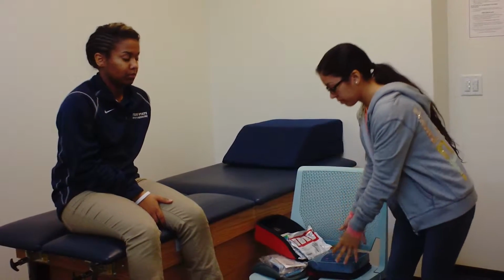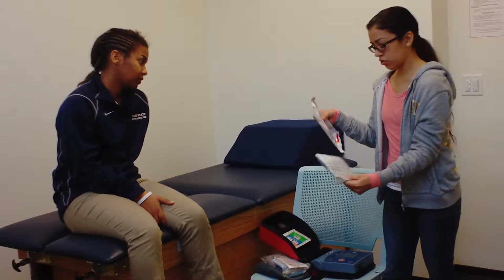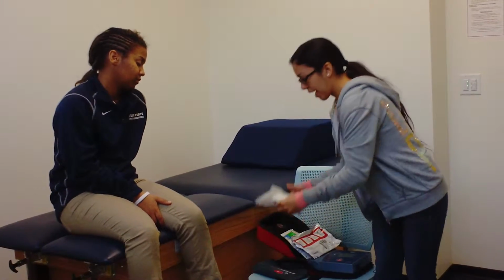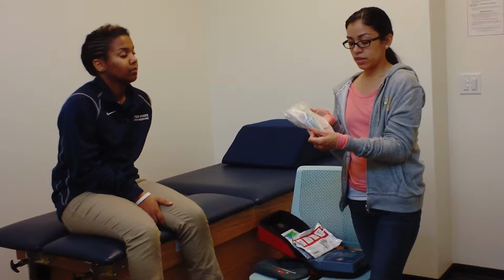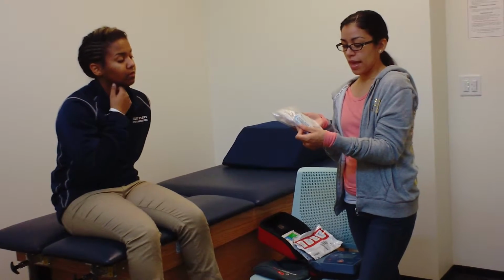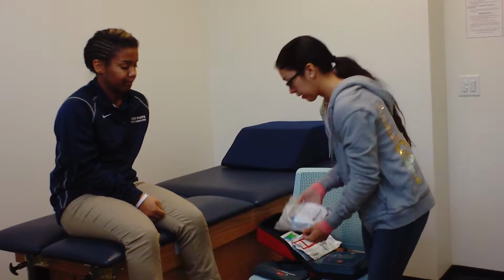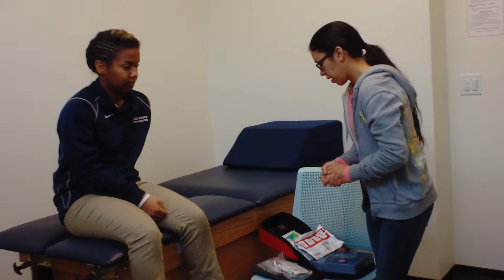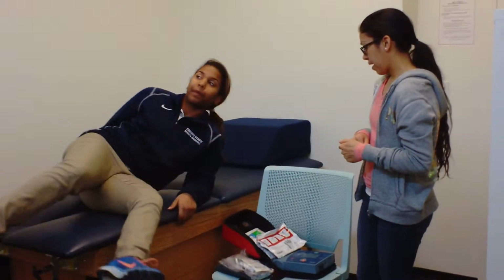An AED, so it's a machine just like this one, is equipped with tabs called electrodes, and also comes with a bag that includes a mask, gloves, shears, a razor, a dry towel, hand towelettes, and cleaning towelettes for the equipment, and a biohazard bag. So, Hallie, I'm going to have you lay down so we can demonstrate how to use an AED.